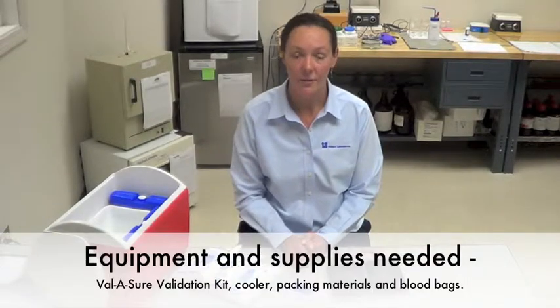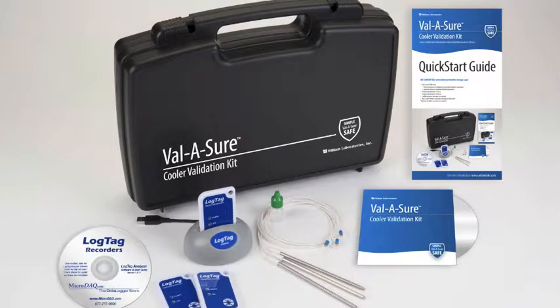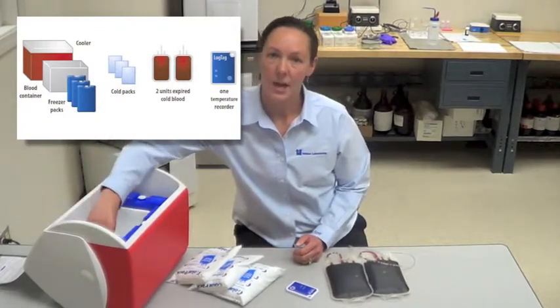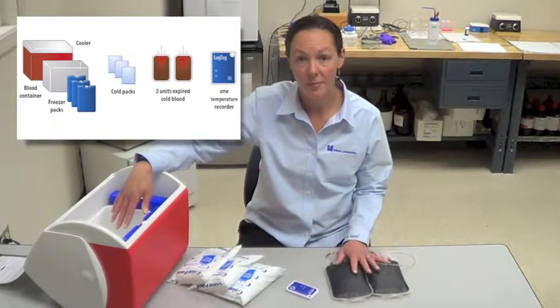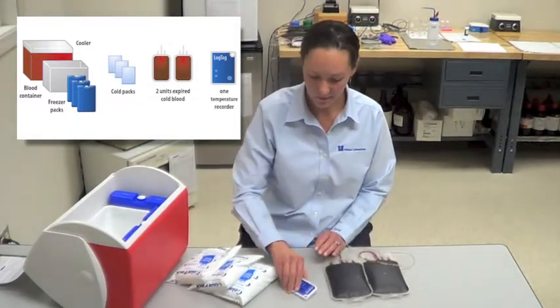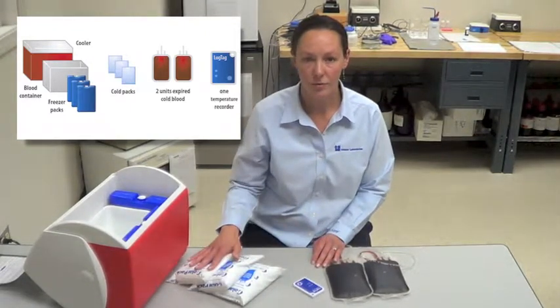Now I'm going to review the equipment and supplies that will be needed for the validation procedure. You'll need a Valishore validation kit, a cooler, freezer packs, a container with which to put your expired units of blood or simulated blood products in, two units of expired blood or simulated blood products, your temperature recorder, and three refrigerator packs.